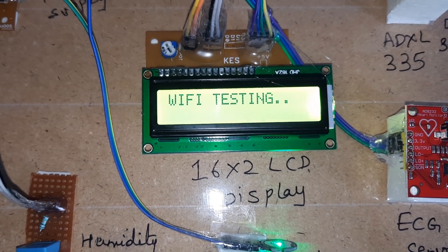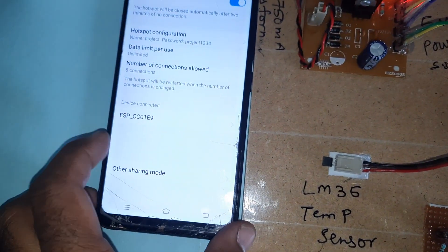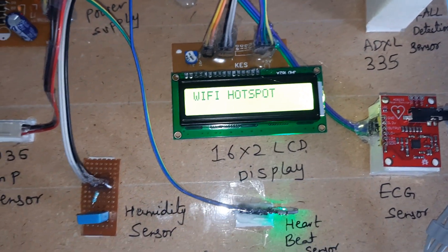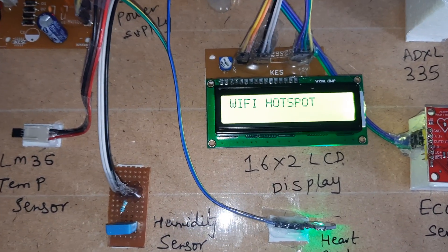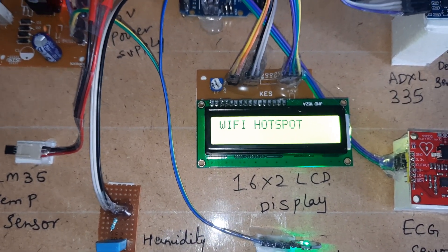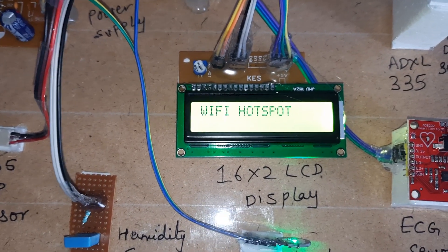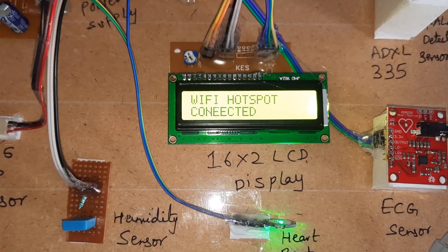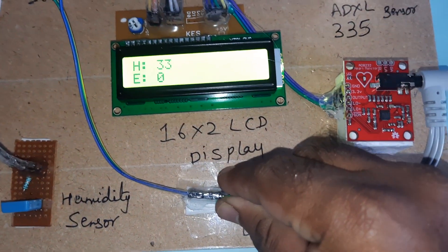The hotspot mobile device is connected and the LCD shows 'hotspot connected'. Once connected, it reads temperature and humidity sensors. After the connection is established, it shows 'WiFi hotspot connected', then T for temperature, and begins detecting heartbeat first.